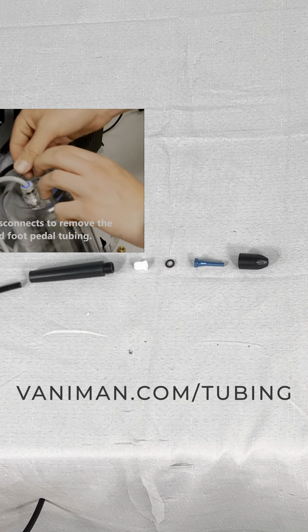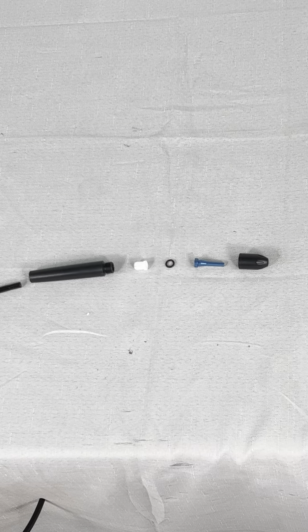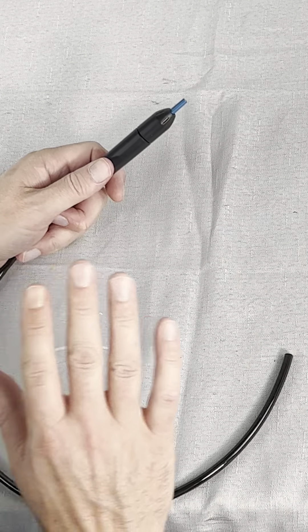We've got another video on how to safely remove the tubing from the rest of the Sandblaster. Check the description below for the link to that video. Once you've got your handpiece and tubing free, you can take it apart.